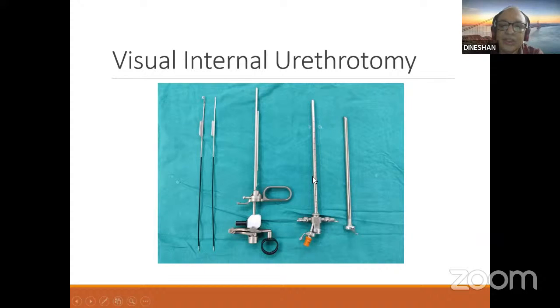And this is the outer sheath. Here the tip is always sharp and rounded, unlike the sheath of the cystoscope telescope. There is no beak here. It is a sharp edge, and so you always require an obturator here.